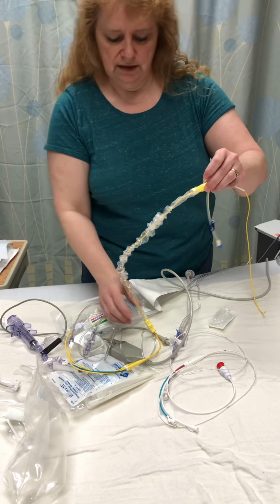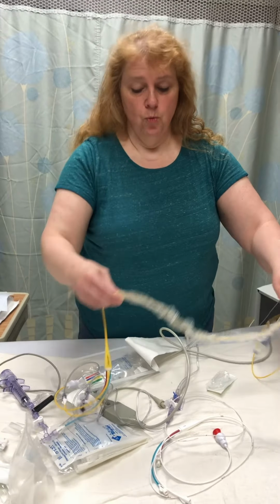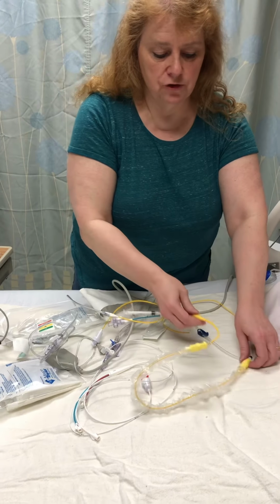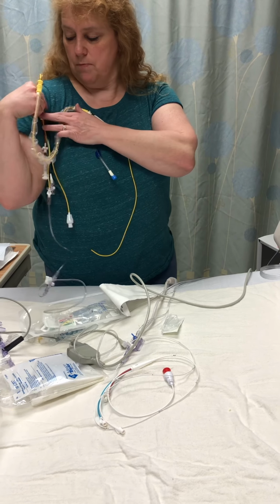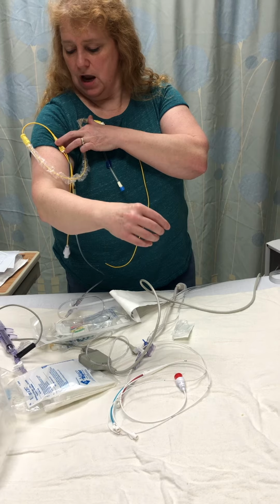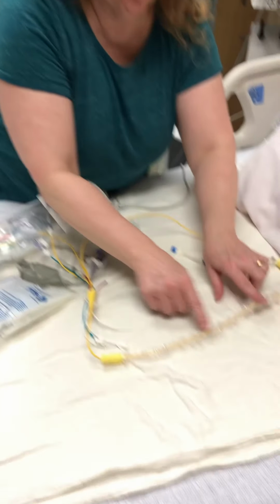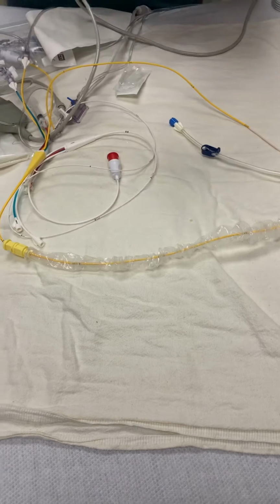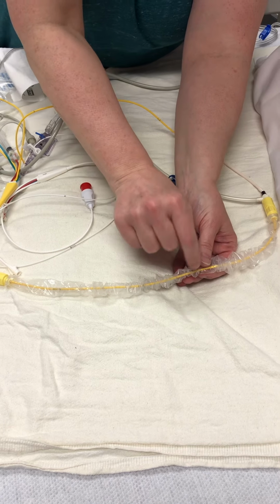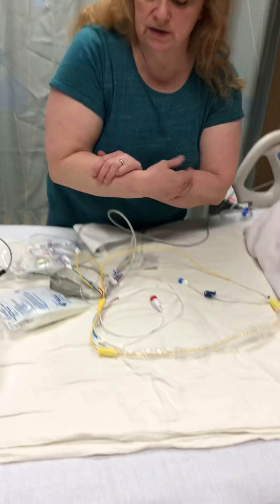it still maintains sterility. But when we're securing this, we don't want to put tape over here. So what you want to do is, if it goes in, put the tape here and then put the tape here and then put tape over this, because if you put tape over this part, if you take off the tape or the tape gets loose, you could potentially cause little micro holes in there, and that would increase your risk of infection.